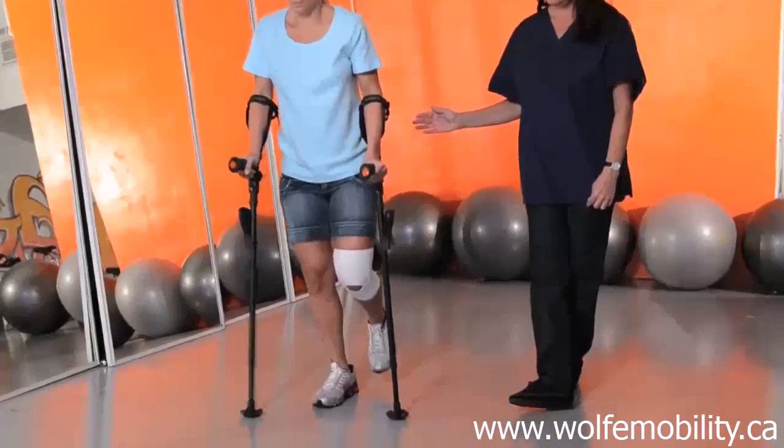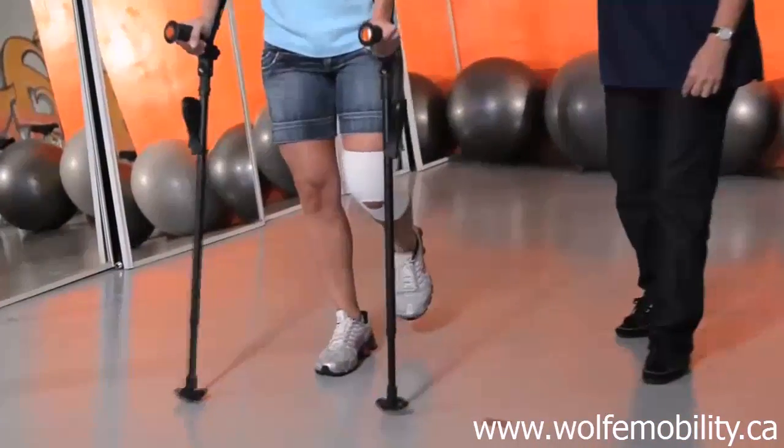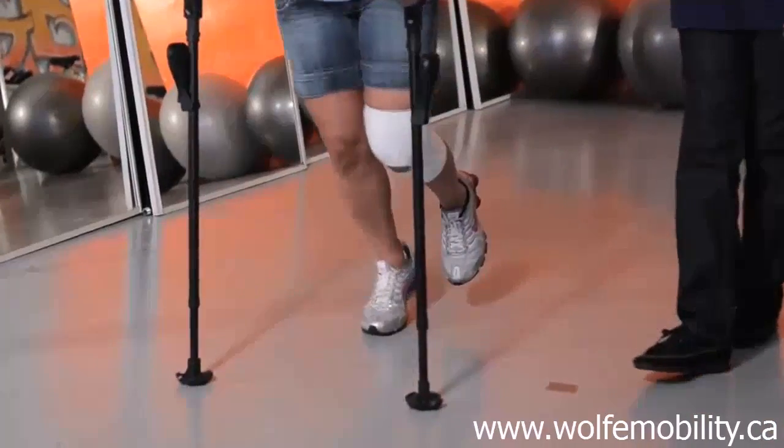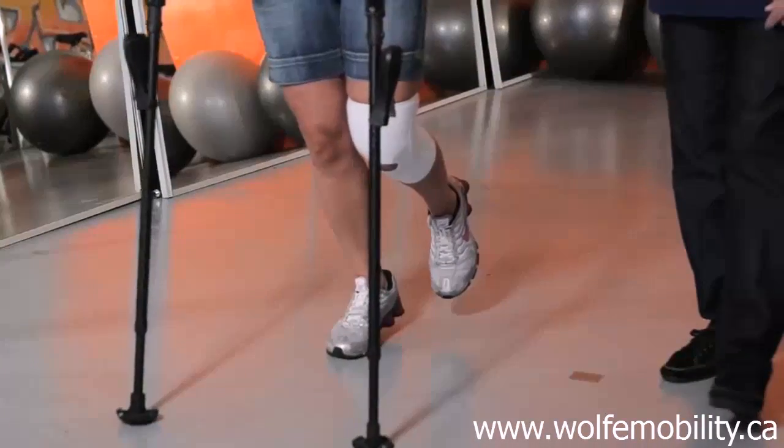Remember, the meaning of the crutches is for the user to transfer the weight away from him or her to the crutches, and not to the affected extremity while he or she strolls.